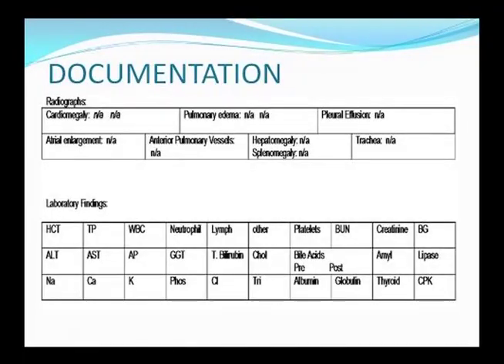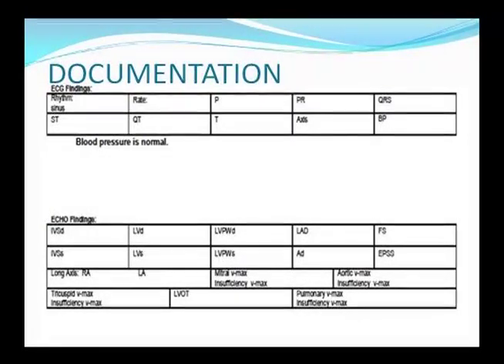Teichholz measurements are based on a left ventricle shaped as an ellipse and do not reflect the true size or shape of a human left ventricle, much less a dog or cat.